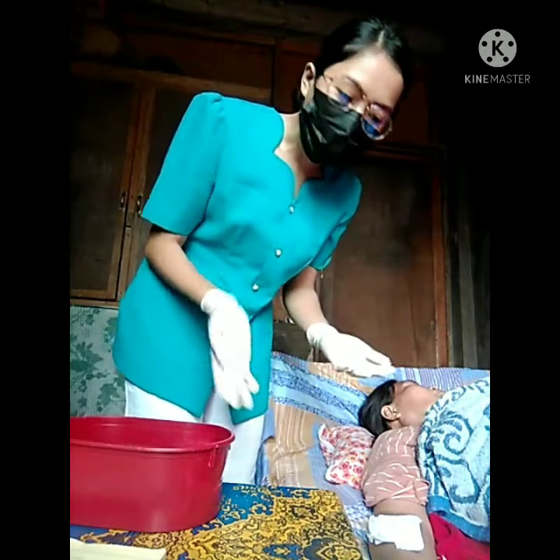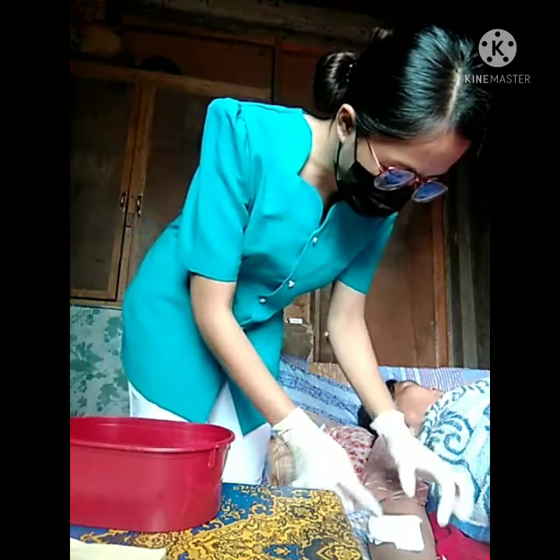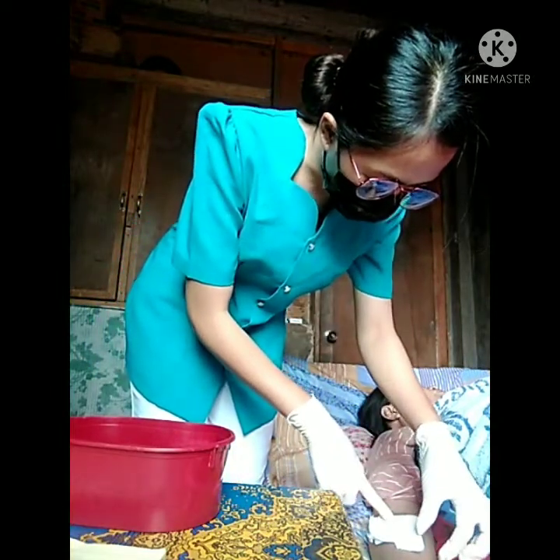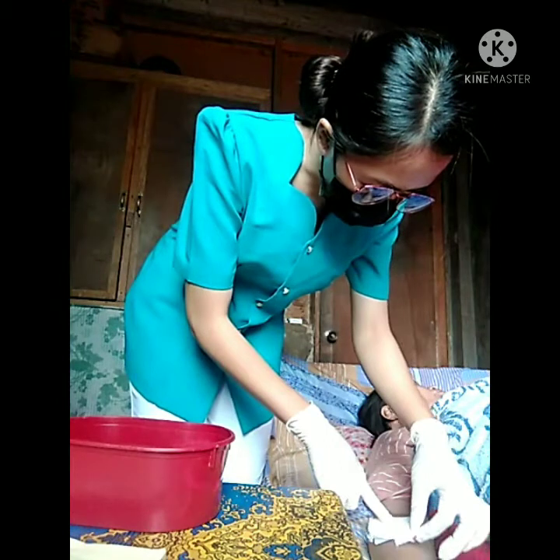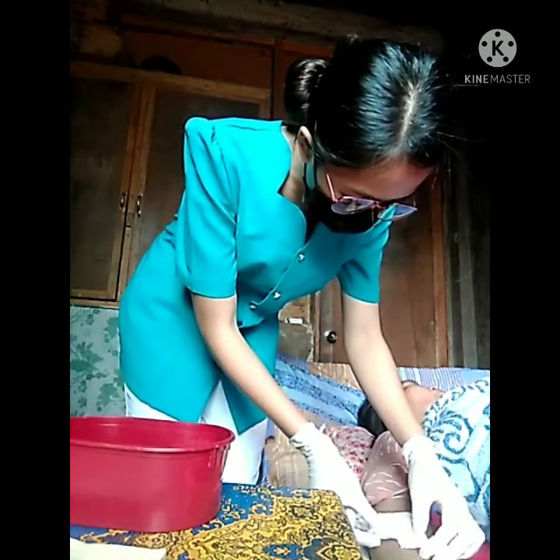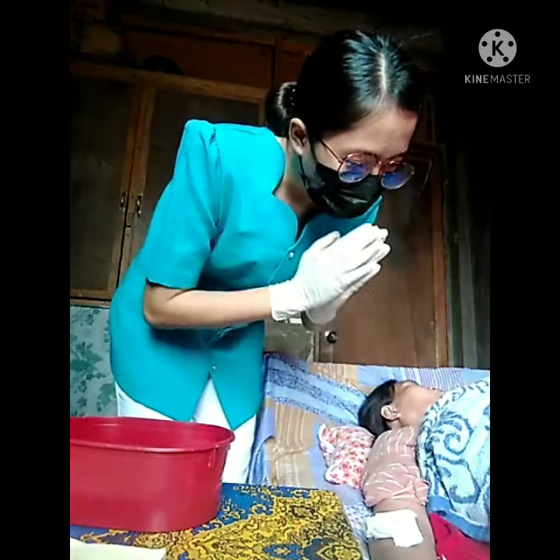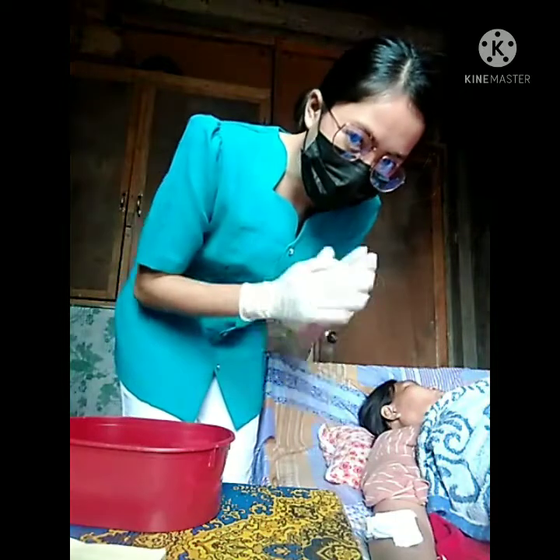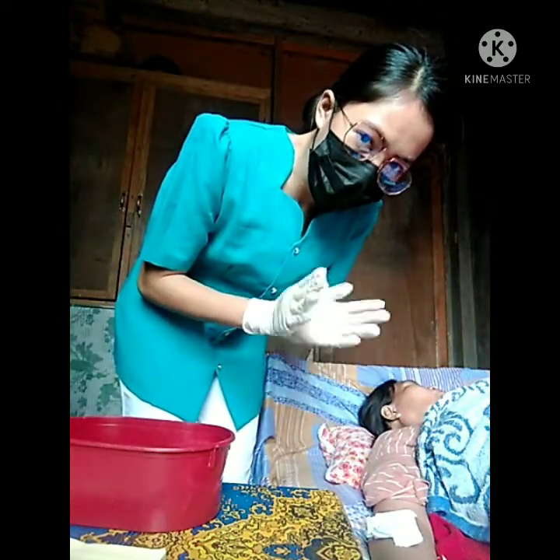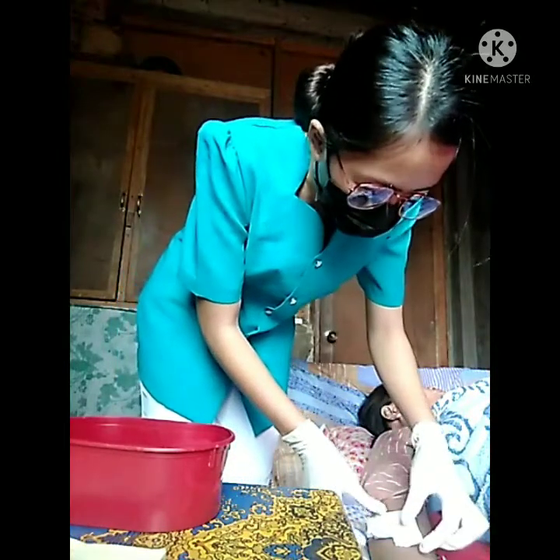With the gloves, gently and carefully remove the gauze dressing one layer at a time, taking care not to dislodge drains or tubes, and keep the soiled dressing away from the client's sight.